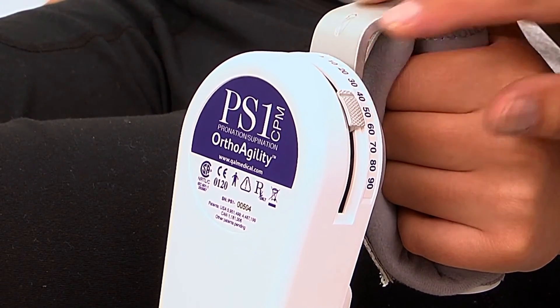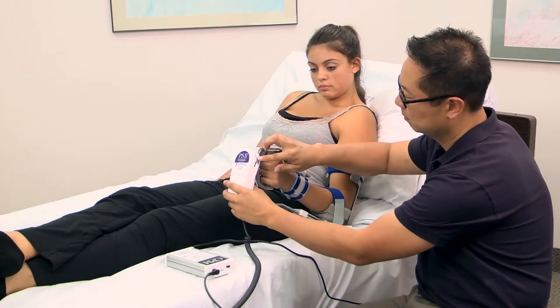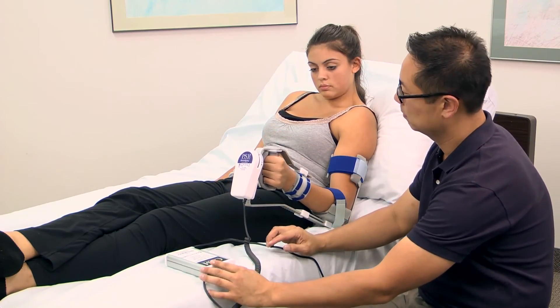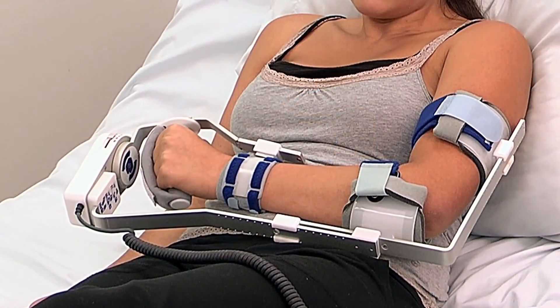To set range of motion, simply push and slide the mechanical stops on the actuator to the desired amount of motion. When ready to start treatment, set the force setting to maximum or minimum and the actuator will begin moving.